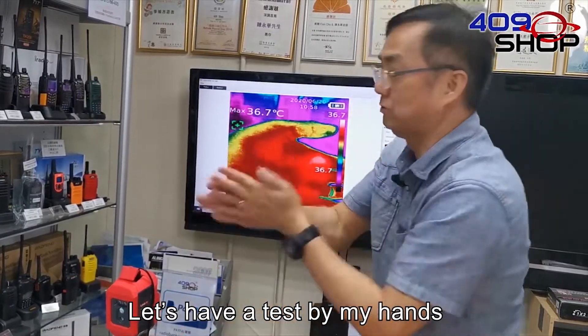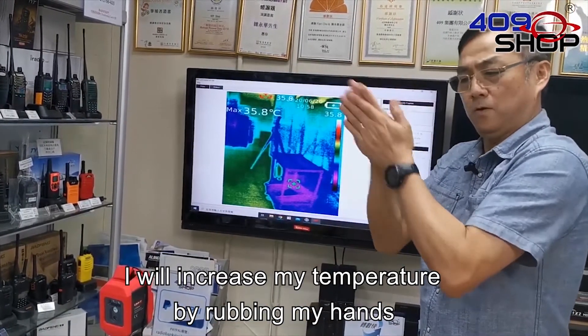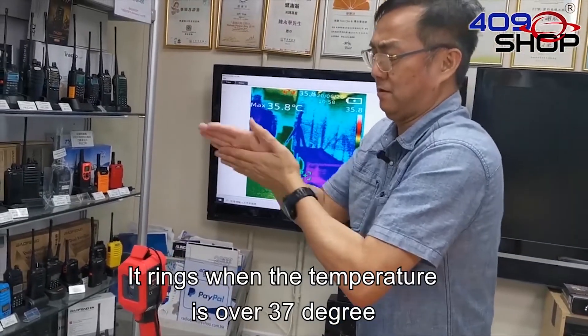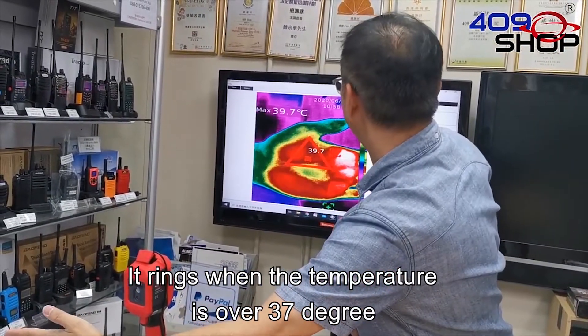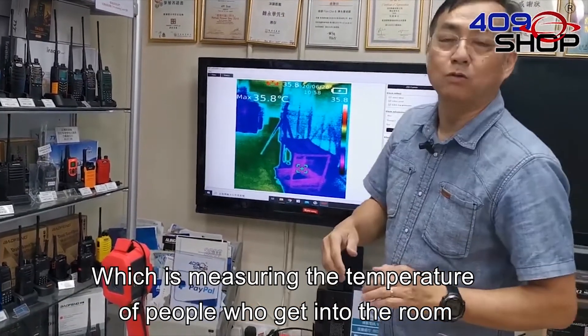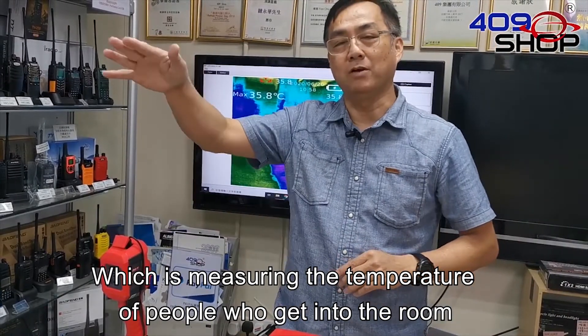Let's have a test with my hands. I will increase my temperature by rubbing my hands. It rings when the temperature is over 37 degrees.